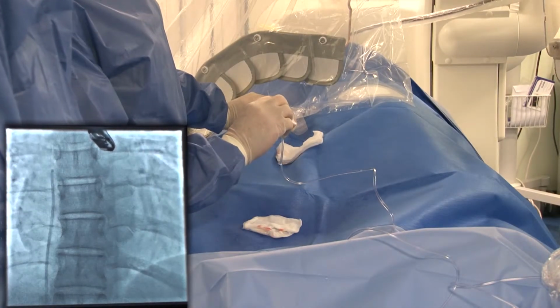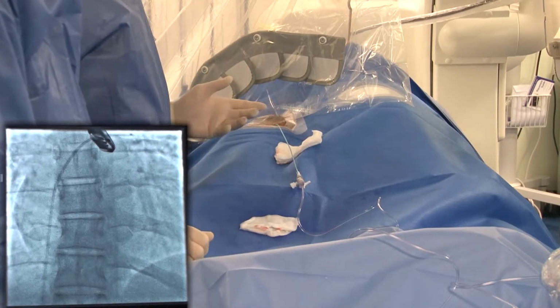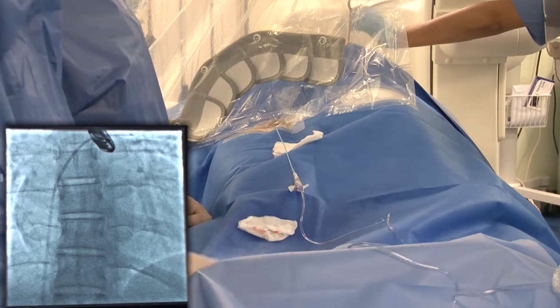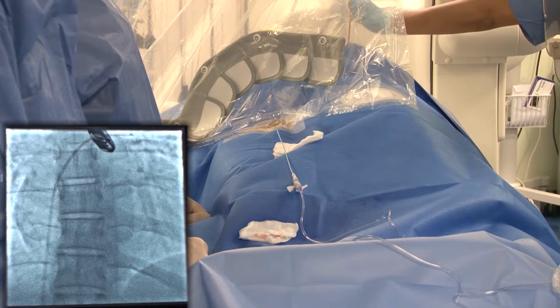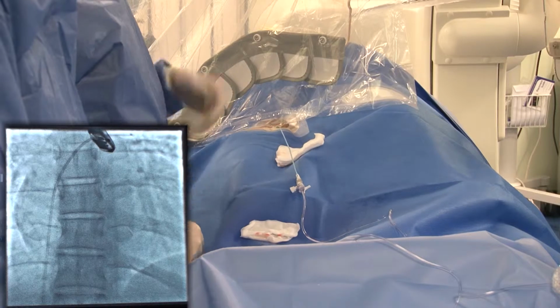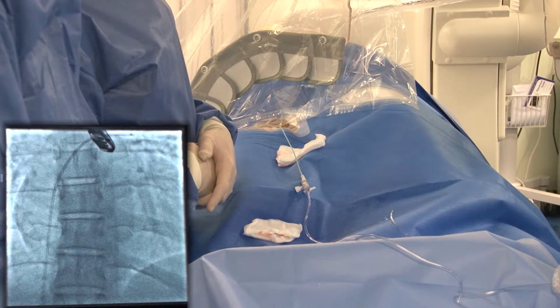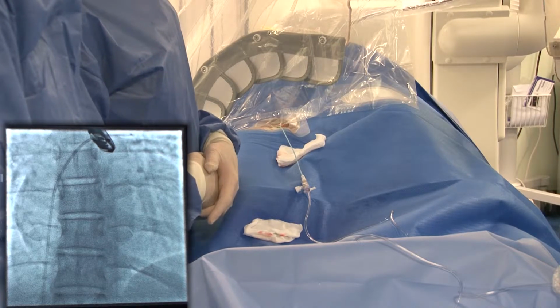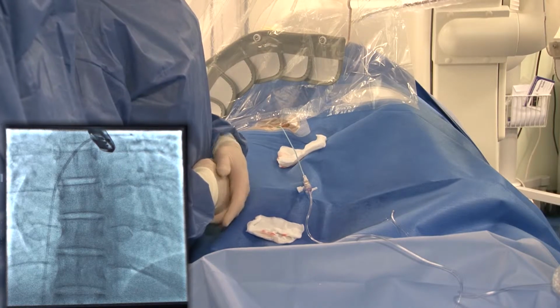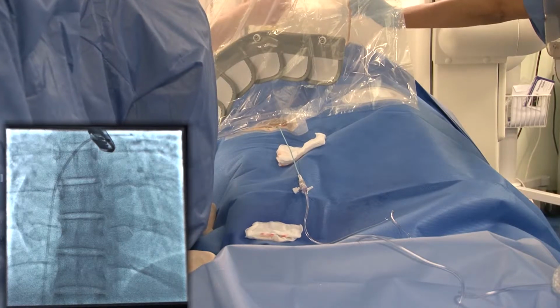People do use a guide wire sometimes to get up through a PFO. That's us across now. Yeah. But I have to say, I've never used a wire to cross a PFO, and I think if you really need to use a wire to get through, it's probably too small to need closing. If there's a reasonable sized PFO, you can get through it with a multi-purpose catheter in every case without the need to poke a wire at the atrial septum. A Terumo wire will go through it, don't get me wrong, it'll go through it very, very easily. But I just don't think it's necessary.